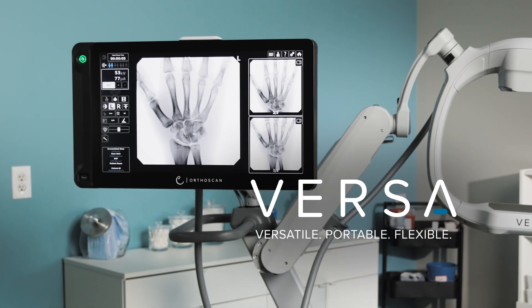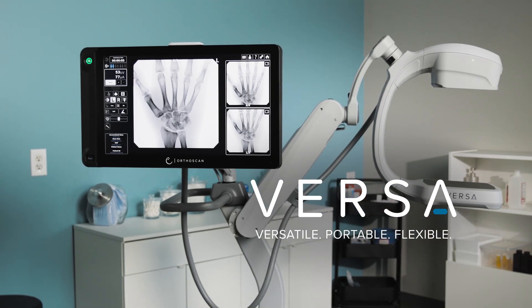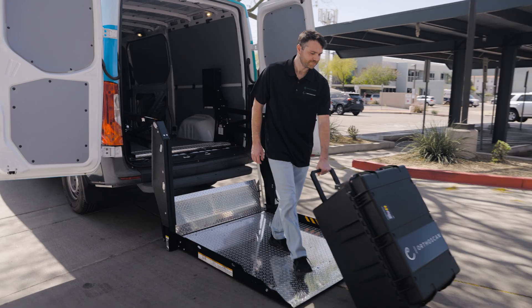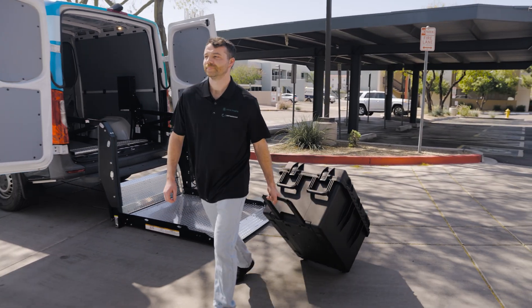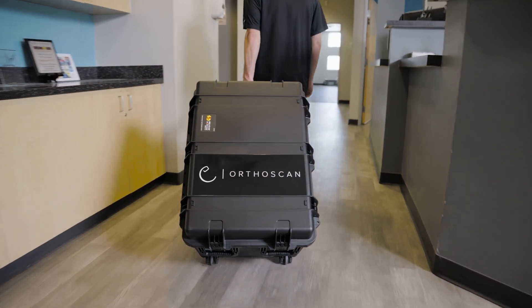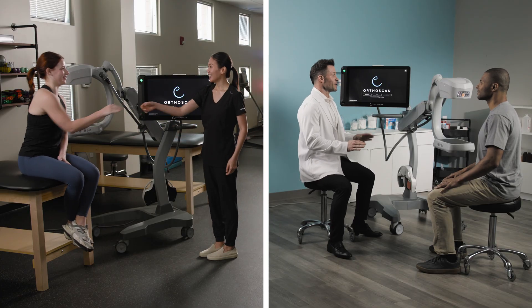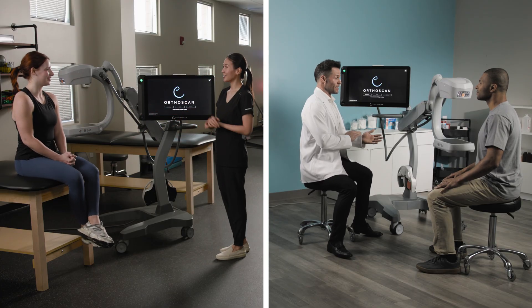OrthoScan Versa — the ultimate portable solution for digital x-ray and fluoroscopy. Versa is a compact, portable, and versatile mini C-arm that allows for effortless transport between satellite clinics and off-site locations, ensuring imaging capabilities wherever you need them.